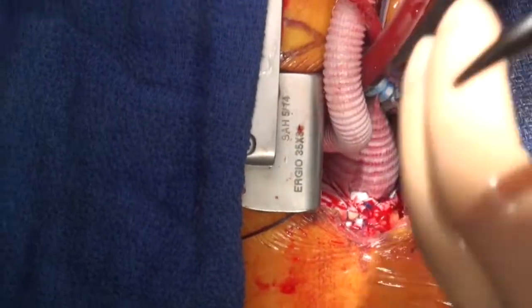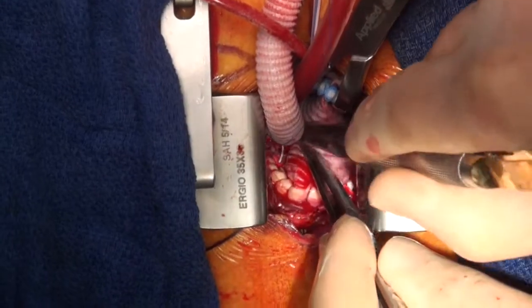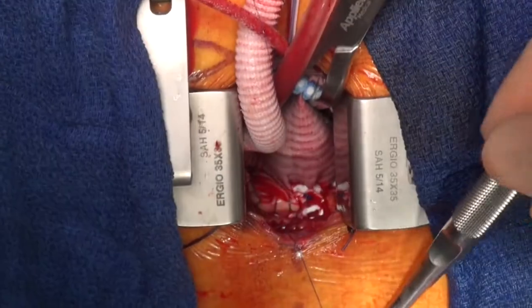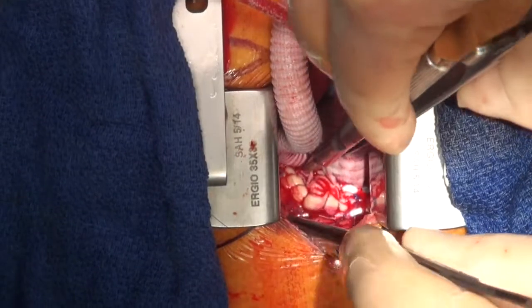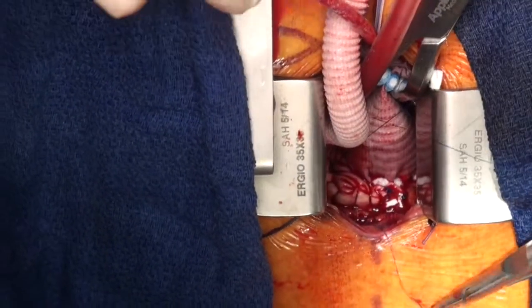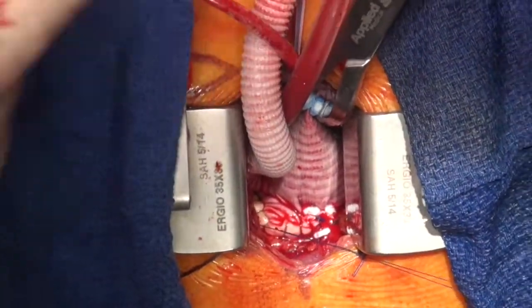You get an absolutely outstanding view even through this very small incision. This is continuing from the previous layer that was on the inside — we're now continuing on the outside. He had a knot just to mark exactly where that inside layer ended, so that no area was left without reinforcement.